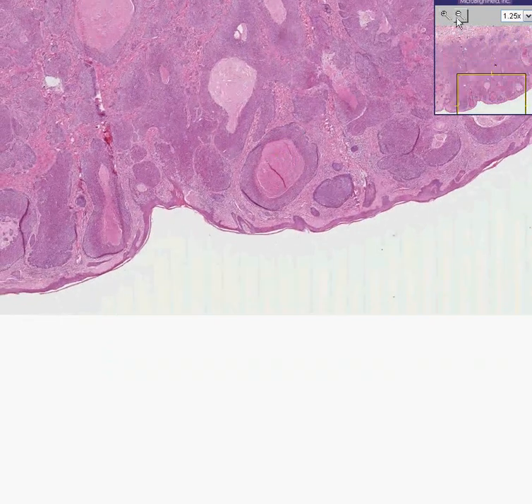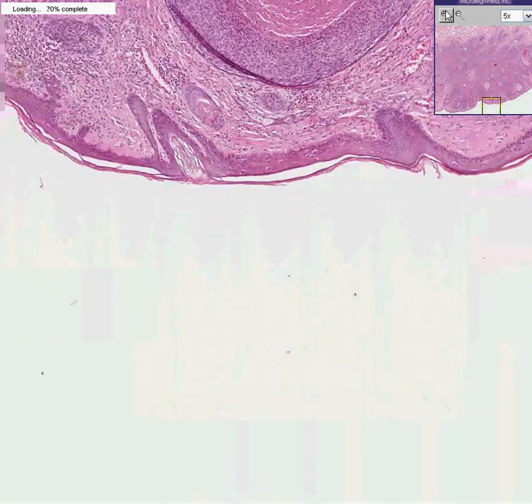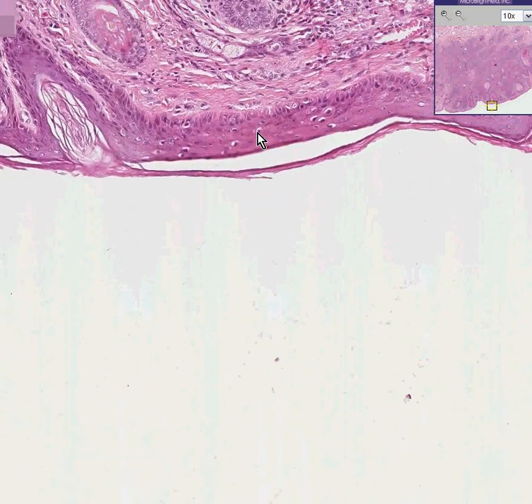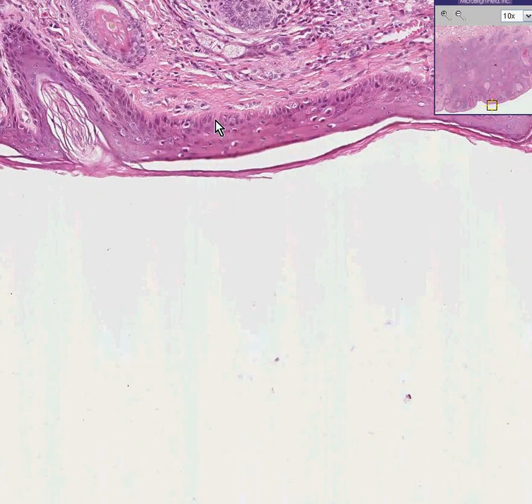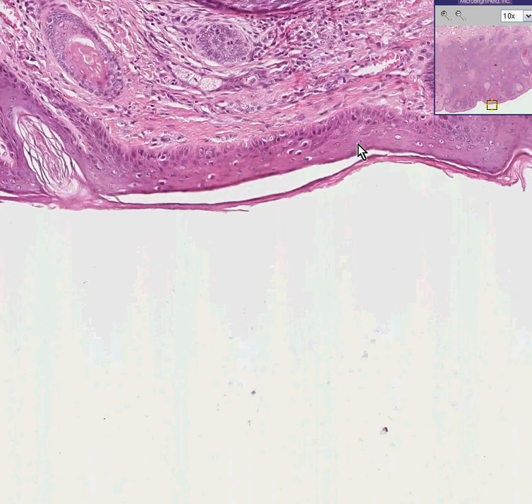Let me show you one thing that is absolutely characteristic of just about all of these tumors. Do you notice that in the normal basal layer of the skin, there is a palisading of the basal cells — they're lined up like soldiers, as compared to the non-palisading growth of the more superficial cells.